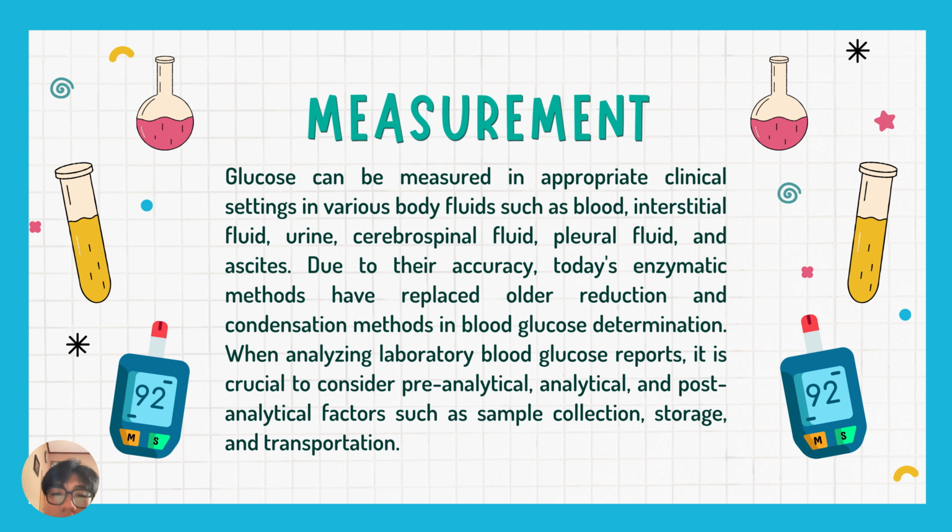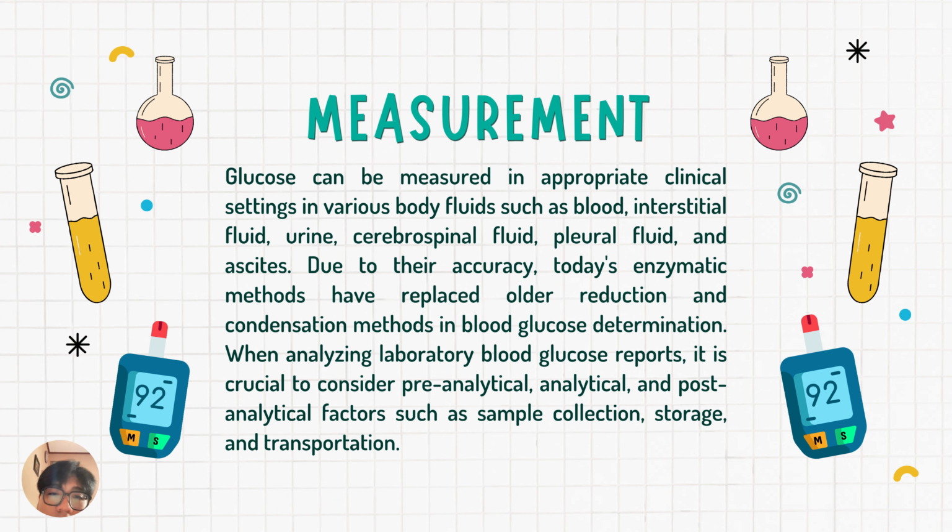Blood glucose testing at remote central hospital laboratories could be more practical and efficient to implement TGC, but due to the inevitable time lag between sample collection and availability of glucose results to clinical staff, it could be unsafe. However, the POC blood glucose meter was developed for out-of-hospital care of diabetic patients, allowing them to control their blood sugar levels. And nowadays, POC glucometers have become more frequently used in critically ill patients.